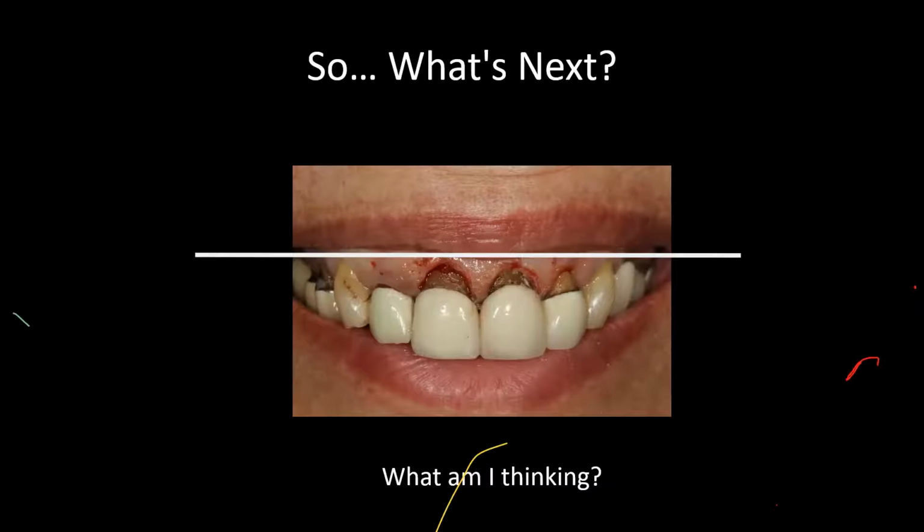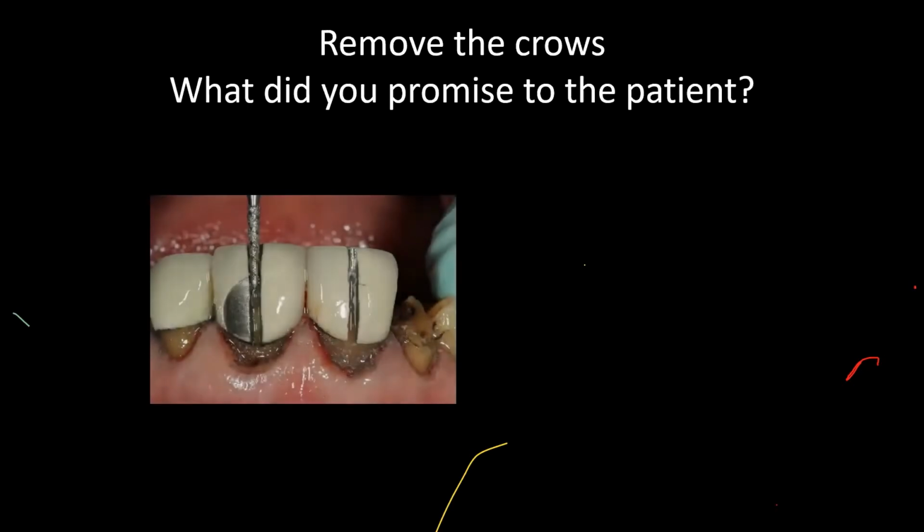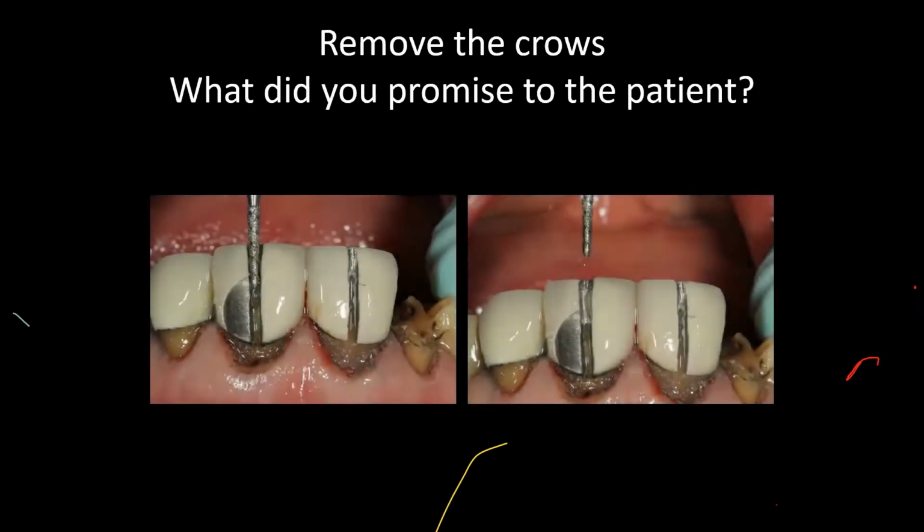The beauty of this is you have almost like a bloodless field. Okay, it's easy to do, and you maintain your proper gingival outline. Okay, to your progression. Like centrals are about similar height as canines. Okay, and maybe it's like similar, while the laterals are slightly low. So normal things that you would normally do in your denture setup, for instance. And following this, we go ahead and we remove the crowns with sectional.